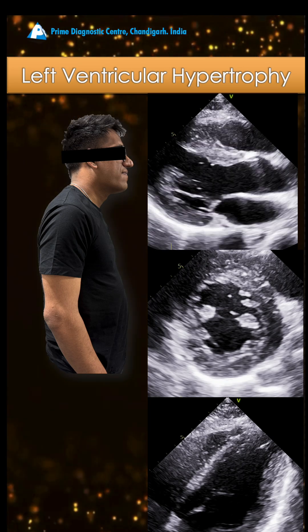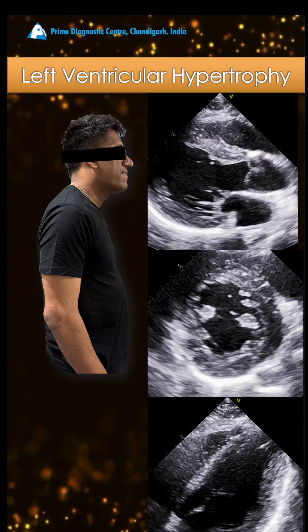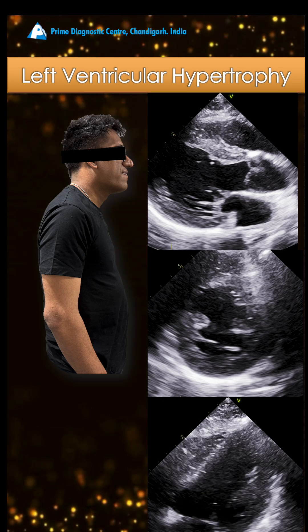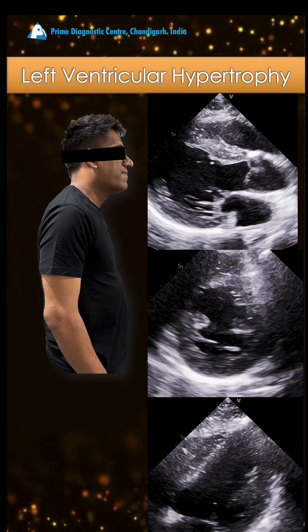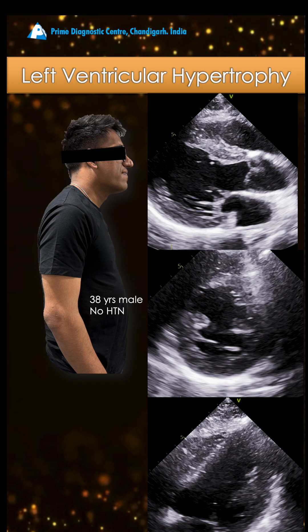You see left ventricle hypertrophy on a parasternal long axis view, short axis view, and tilted apical four chamber view. This is a person who does not have hypertension.